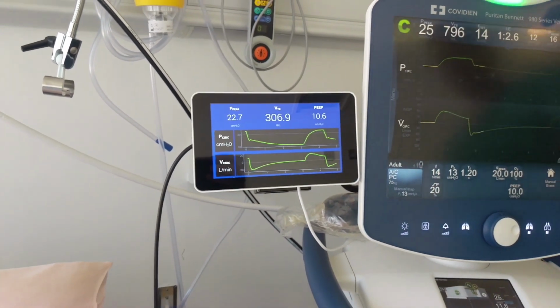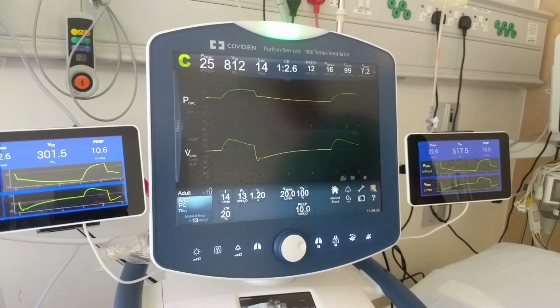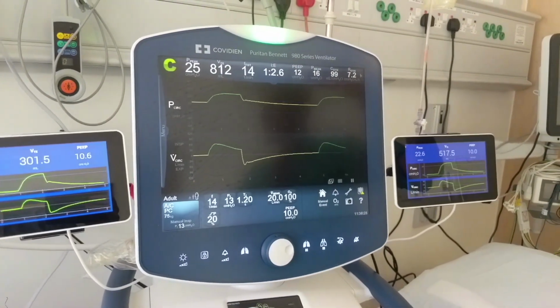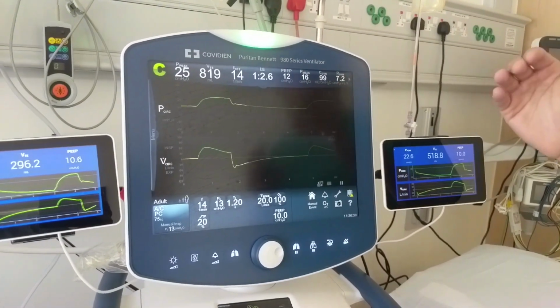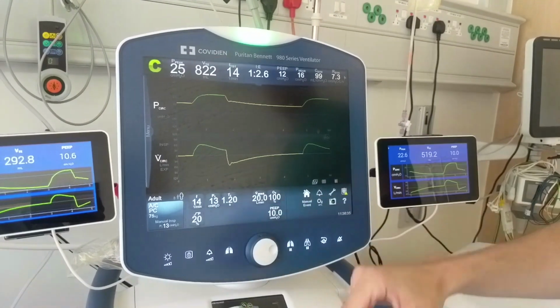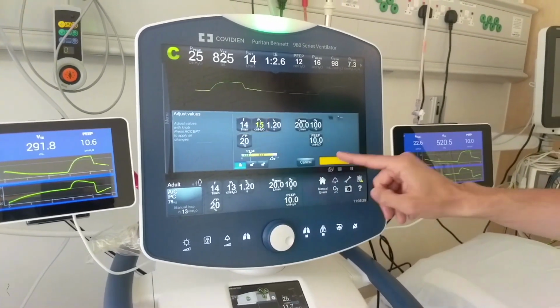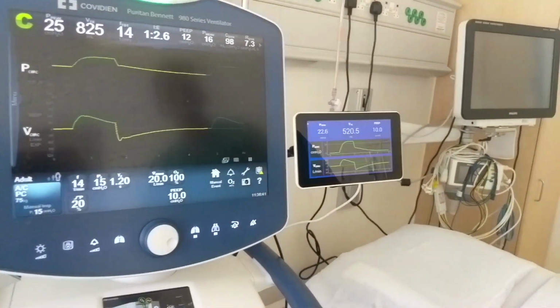We turn now to the main ventilator. The way in which we suggest increasing the tidal volume of the higher of the patients, i.e. the patient who has the greatest tidal volume requirements, is by altering the inspiratory pressure on the ventilator itself. So we'll go to 15 and we'll monitor for the effect of that.